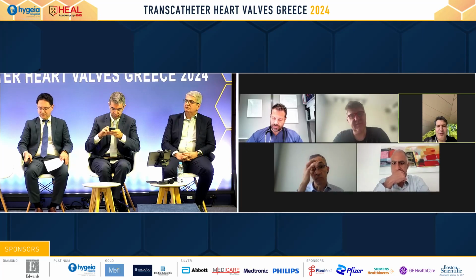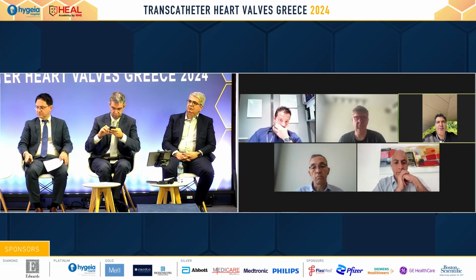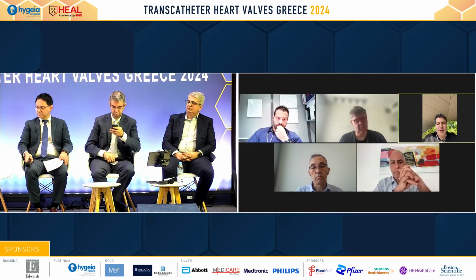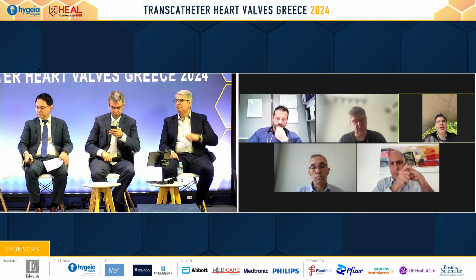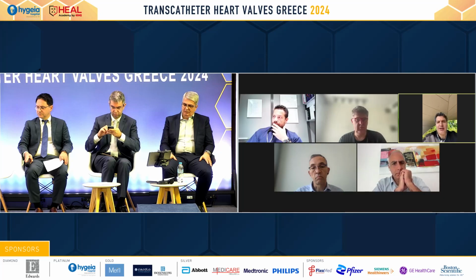Yeah, thank you for the kind invitation again, and for your questions. For the first question with regard to the ring, I'm using nowadays predominantly bands. And the reason for that is, as you know, there is no annulus at the level of the aortomitral curtain. That is a dynamic place of the annulus.